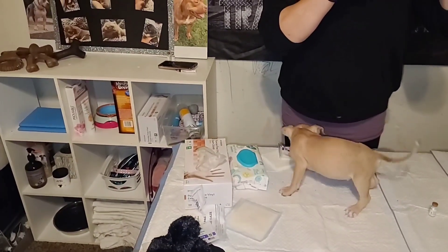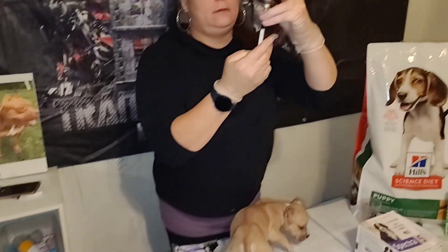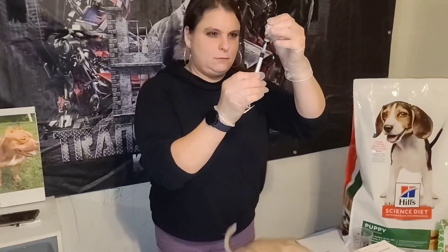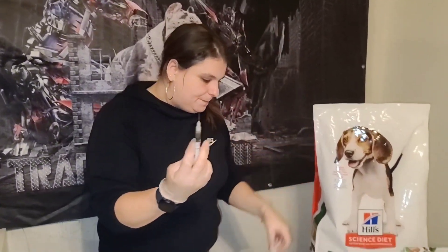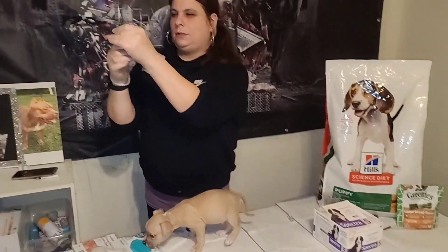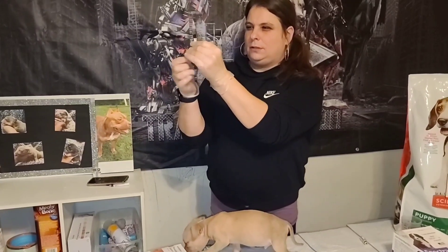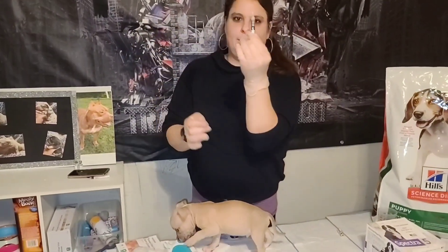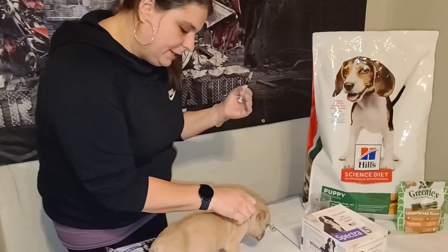So you're ready to draw up the vaccine. Make sure you don't have any air in it and that you get all of it out. Get the air out first. That should be one ml.